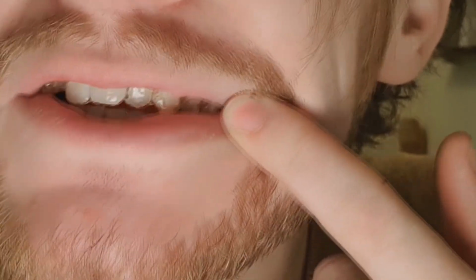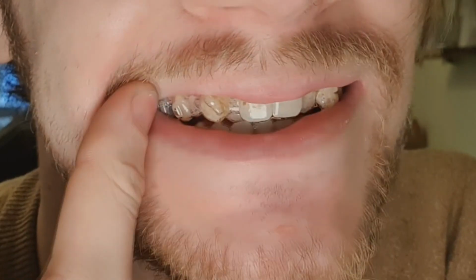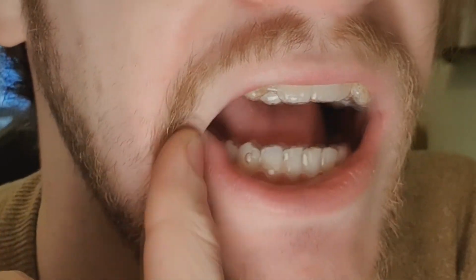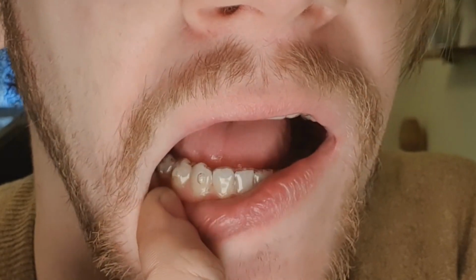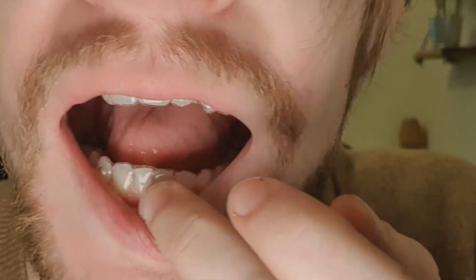As for the attachments themselves, now you won't see them that well with my aligners in, but they're just little bumps. The most obvious ones being on this canine, some nice small ones on the bottom. So yeah, for me it's not been any bother having those things on show. I don't really show my teeth anyway, so having these bumps on them makes no difference to me.